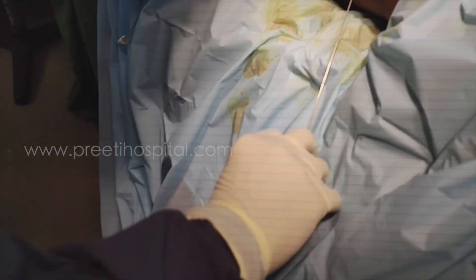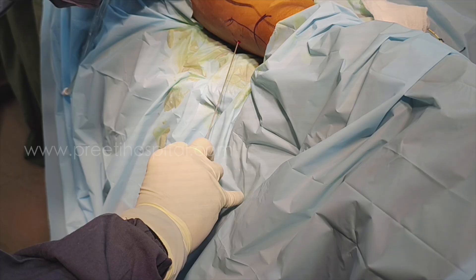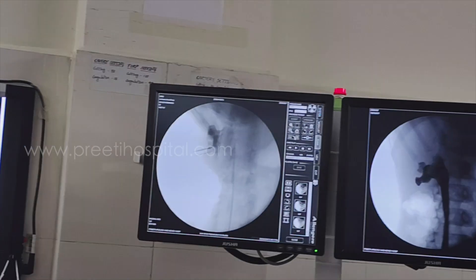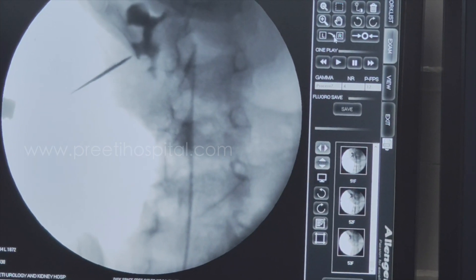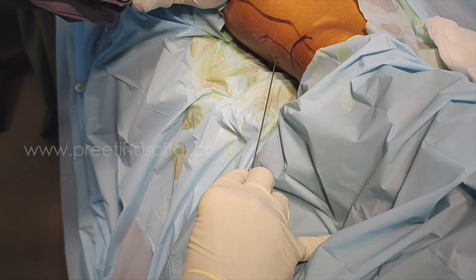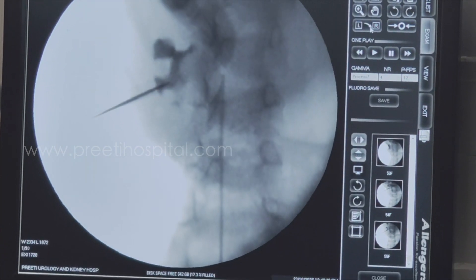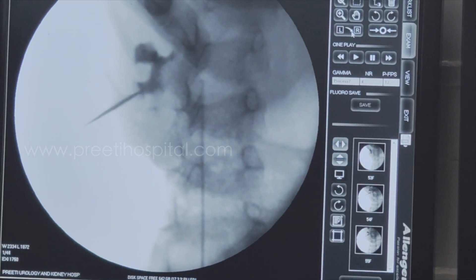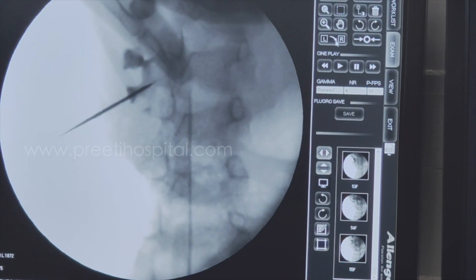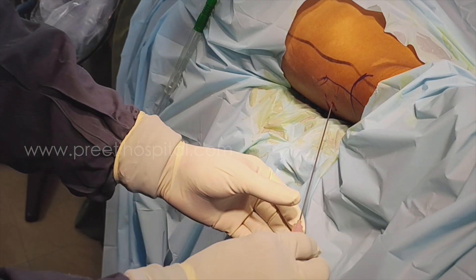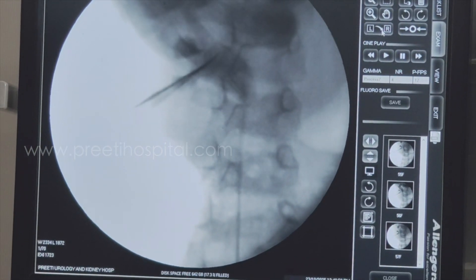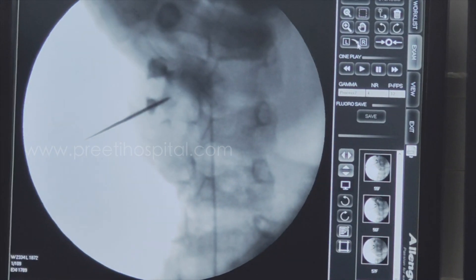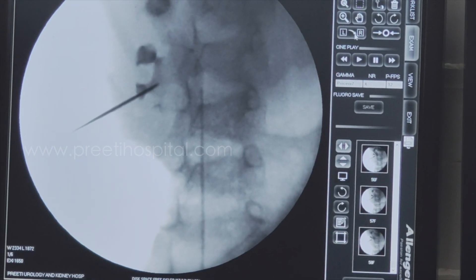Go posterior, go posterior — see how much it is dipping. Now in 30 degrees it is still a little lower. I have punctured at 30 degrees. Now move to 0 degree with contrast — see, it is perfectly in place. Now I will remove the needle slowly without moving. I expect water — I will withdraw a little bit because I need to get to the periphery. I will get the guidewire to pass.